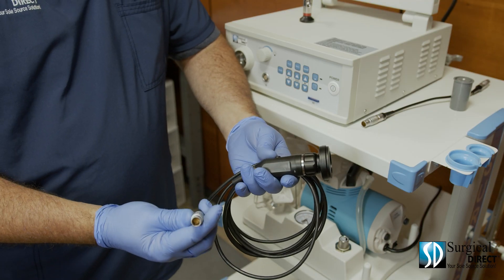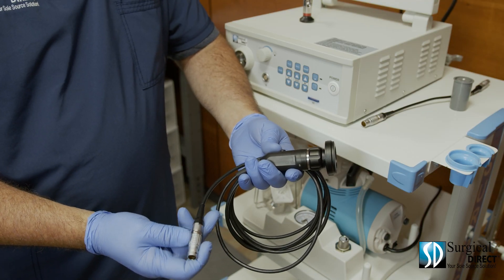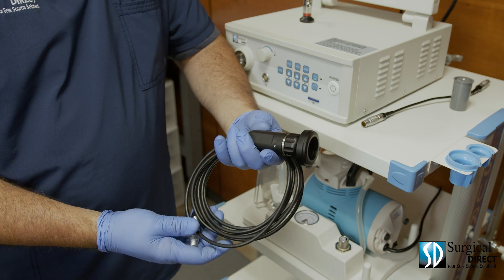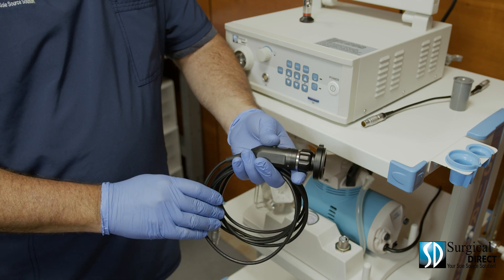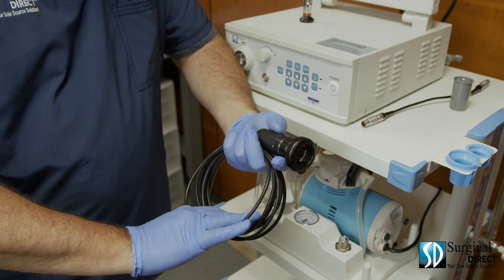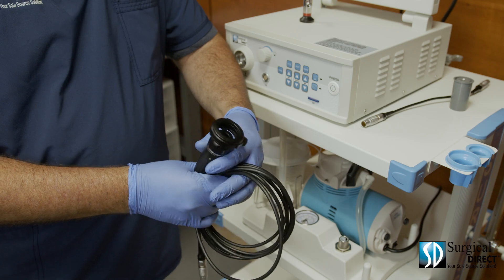The veterinary camera head does not come with a soaking cap. It is not submersible and it is not autoclavable, though it can be gassed. Simply use a soft moistened sponge to thoroughly clean the external surfaces of the camera.